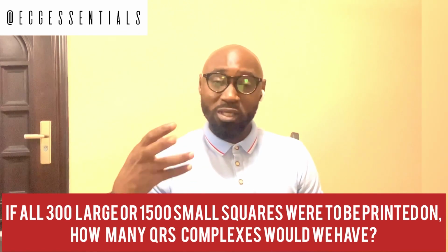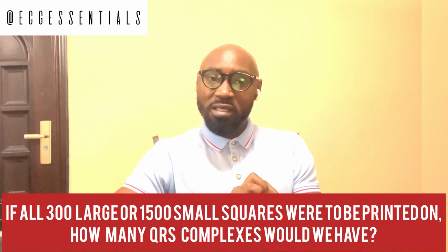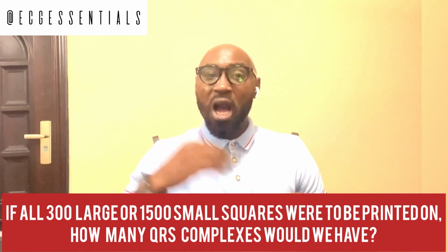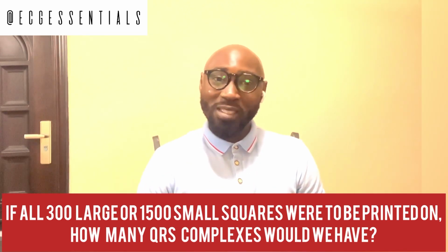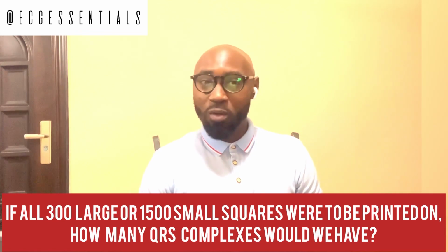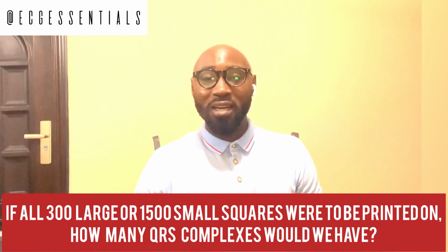Of course, these QRS complexes represent the ventricular depolarization that represents the pulse that we pick. How many of these QRS complexes will show up if we were to print on all these 300 large boxes? And that is simply why we do some of these divisions to help us arrive at the heart rate.